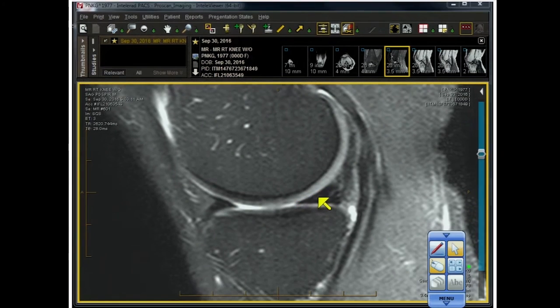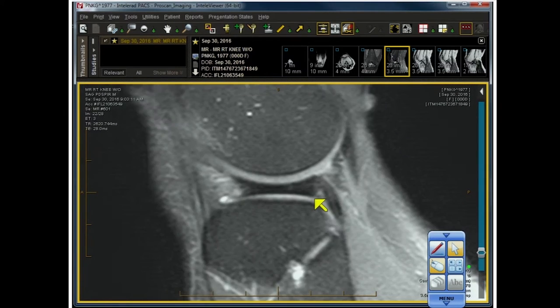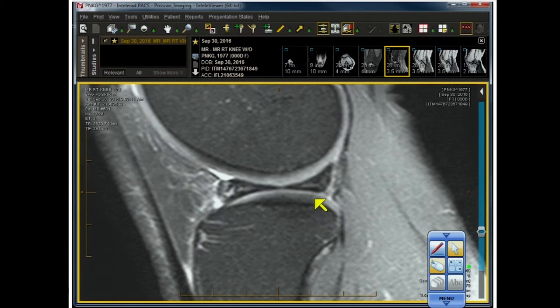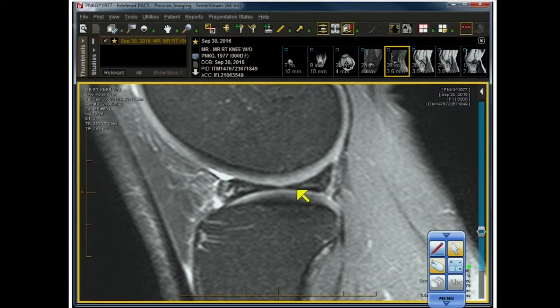Now let's go back over to the lateral side — this is the only case we're going to understand today. I want to focus on a few terms. Notice that as we scroll, the meniscus really never comes back together; there's always a connection to the bow tie, and that shouldn't happen. If that happens, you've got meniscal dysplasia. The most common type is either an incomplete or complete form of discoid lateral meniscus, which this is. But I'm not so interested in the dysplasia right now — I'm interested in some terms.